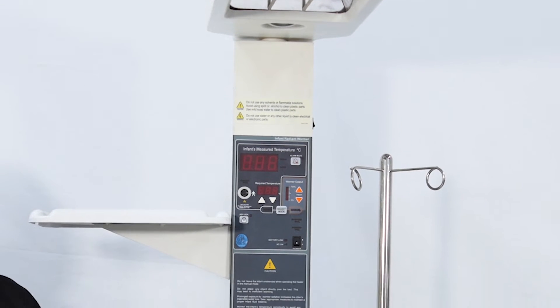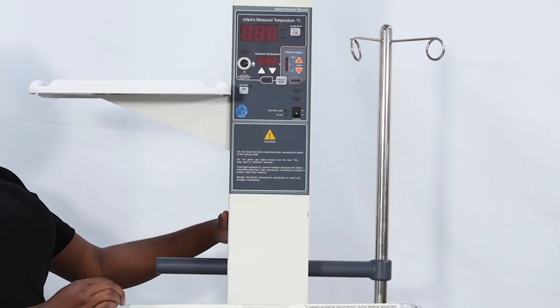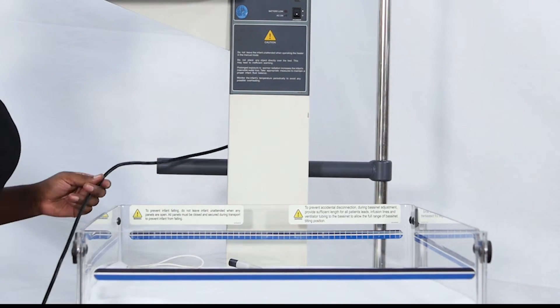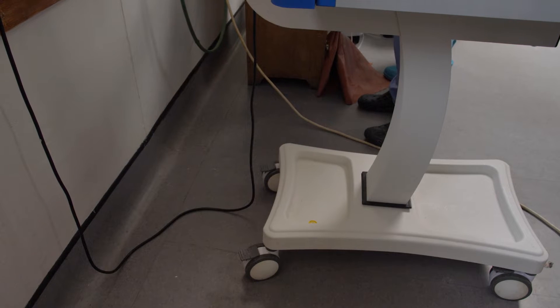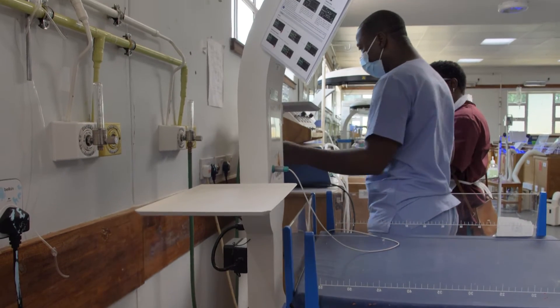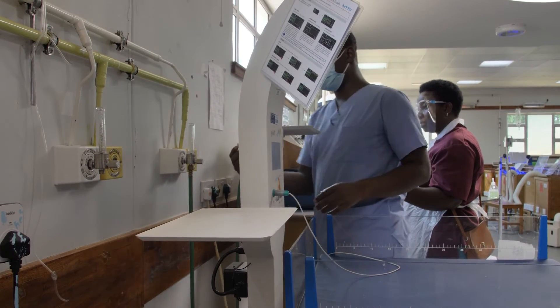Radiant warmers use a lot of power, so they should not be plugged into extension leads. Plug them directly into the wall with a surge protector. They should be placed with the back of the machine against the wall, away from open windows or direct sunlight.